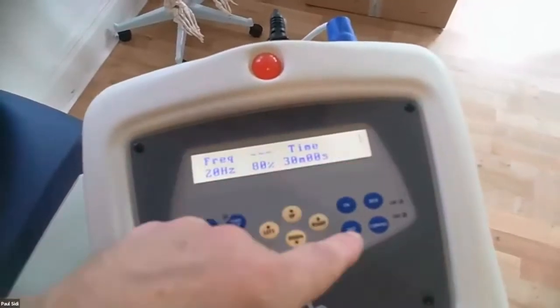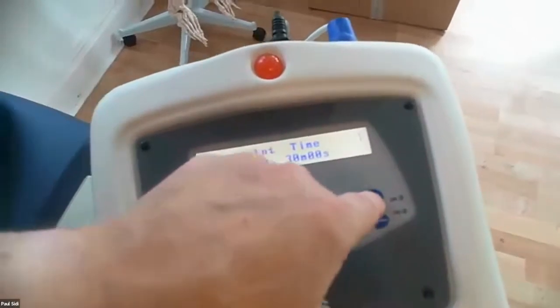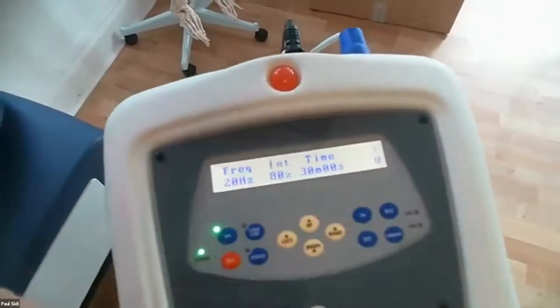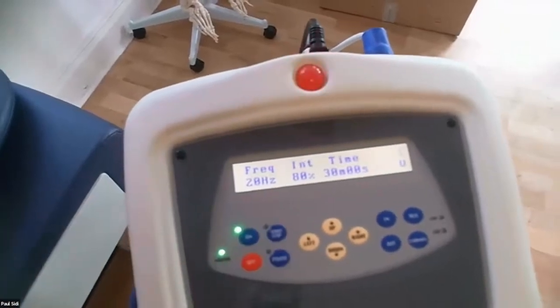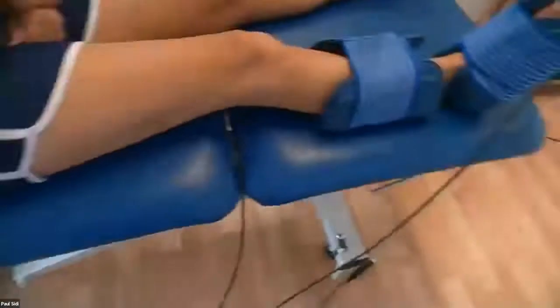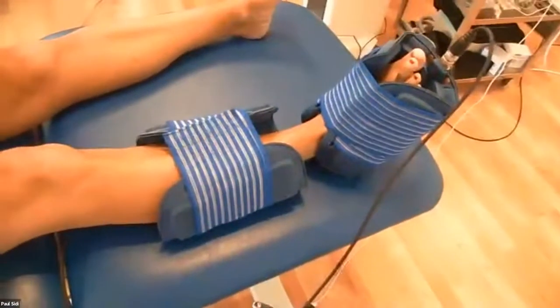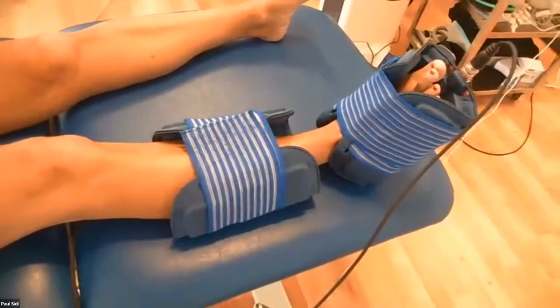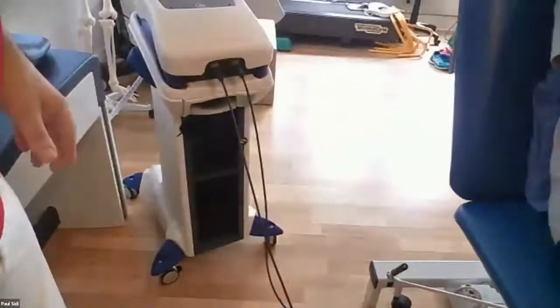Oh, actually, I'm also going to put a little vibration on there so she can feel it's happening. And then we just start that. Okay, start. So I get that going. Can you feel something happening there? Okay, so Francis, you can feel that. And what's happening is we're really preparing all these tissues for the laser. Right, I'm going to stop that because I'm going to show you the bed as well that we can use.